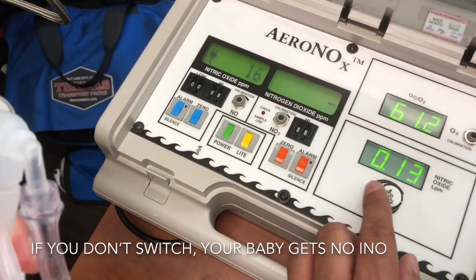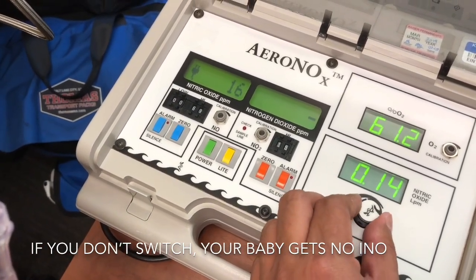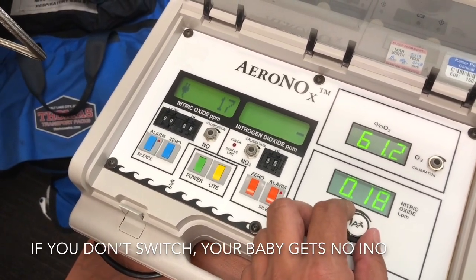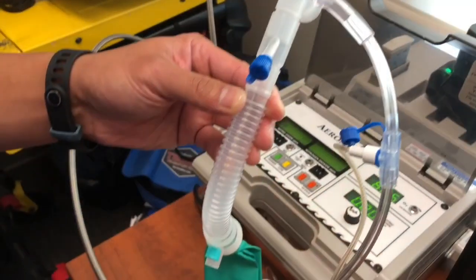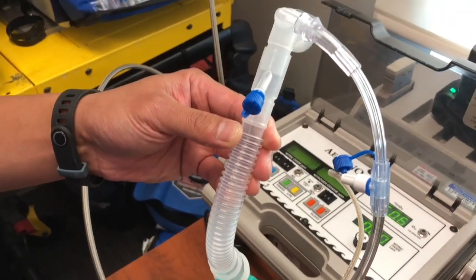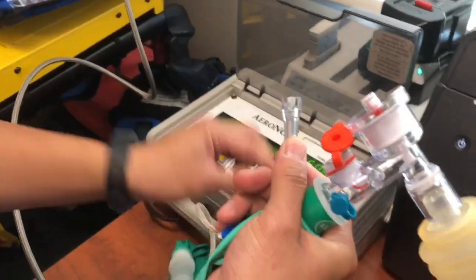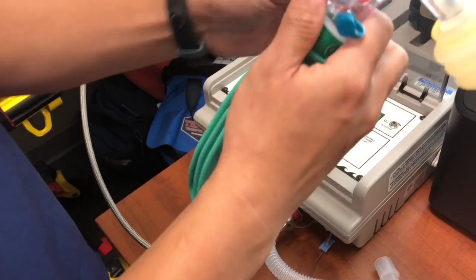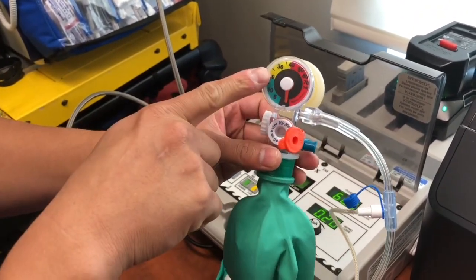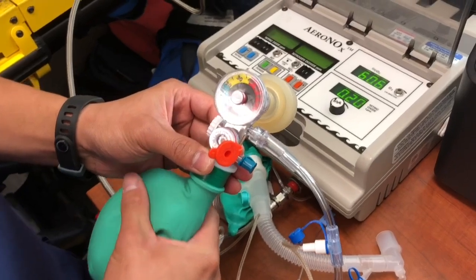Now you just dial in how many parts per million you want to bag the patient at. We're going to switch things up — we're using the AeroNOx bagger, but the problem with it is that there's no manometer. So we're going to go ahead and disconnect and use our regular flow inflating bag. You can still deliver and measure nitric the same way.